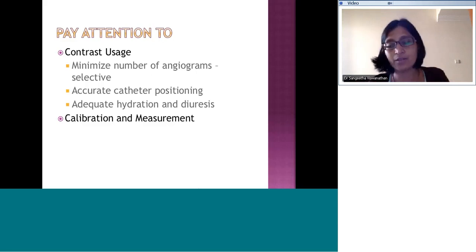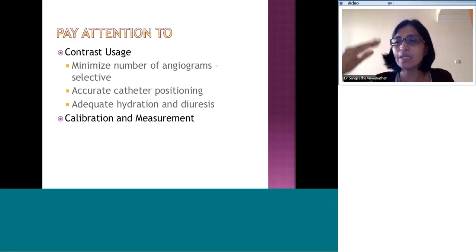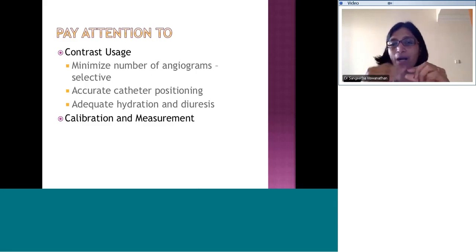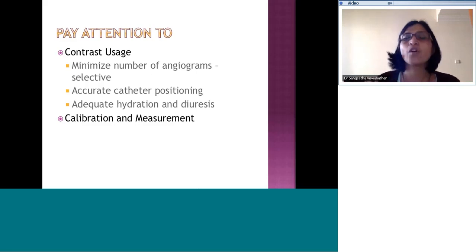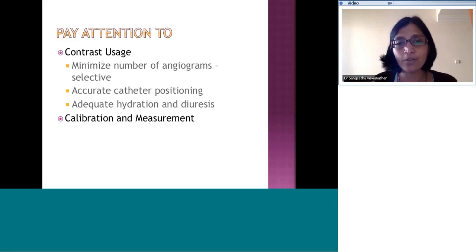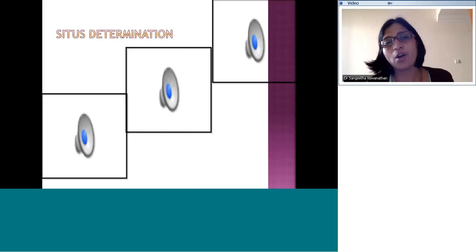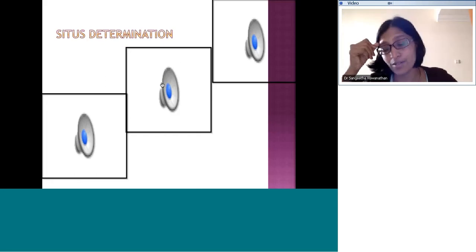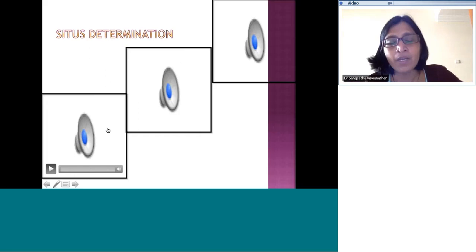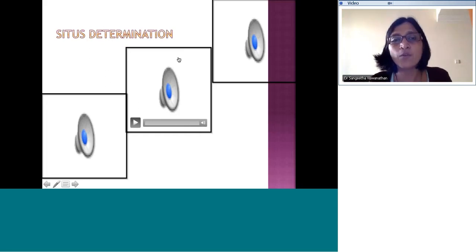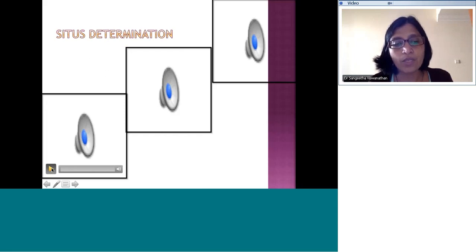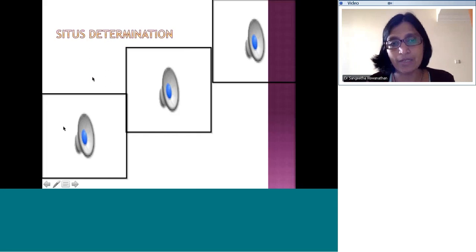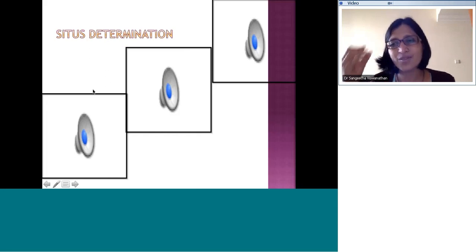The newer angiographic systems have inbuilt calibration techniques, but older ones rely on the operator manually calibrating based on the angiographic catheter. Always pay attention to calibration. For example, you can use marker pigtails in older patients for more accurate calibration, but you need to know which points to measure from — distal to distal or proximal to proximal. These are small details but it is your responsibility to have this knowledge before embarking on a procedure. The rest of the talk will be very practical, looking at optimal views for the various structures we normally examine in the cath lab.